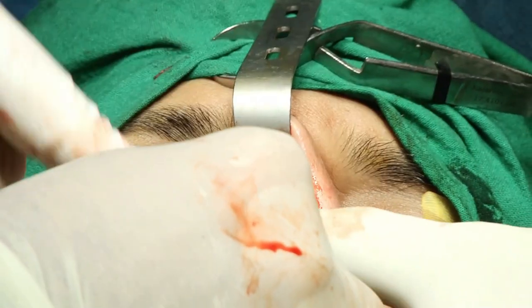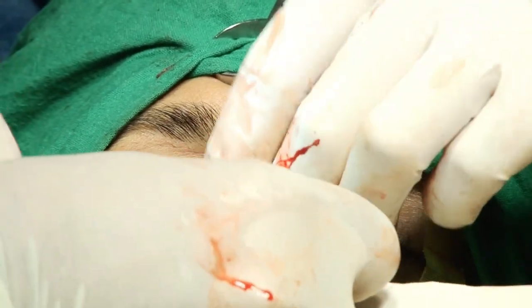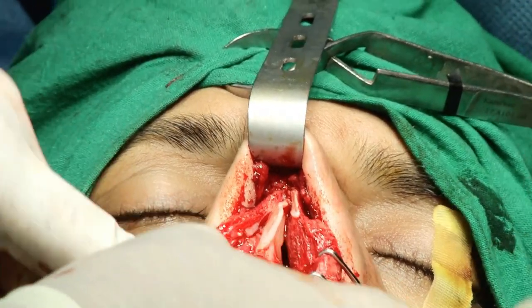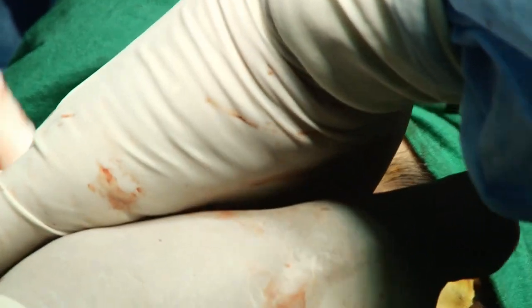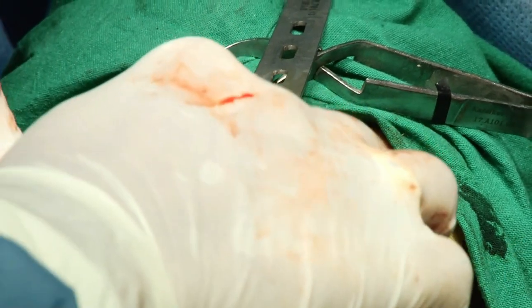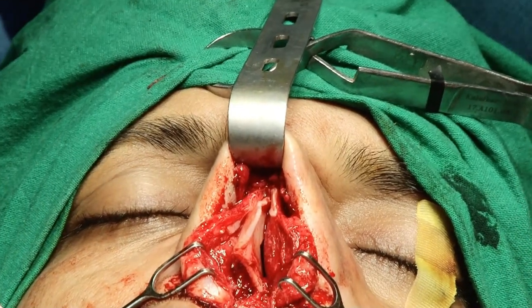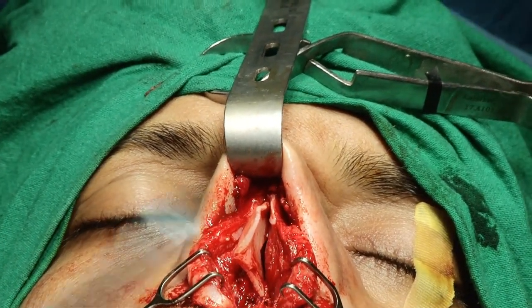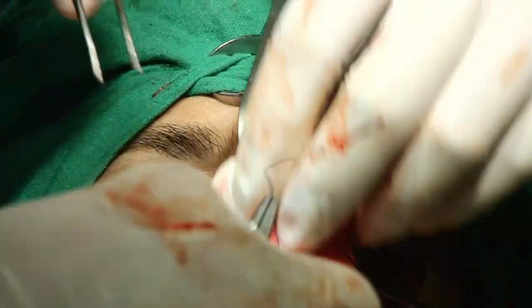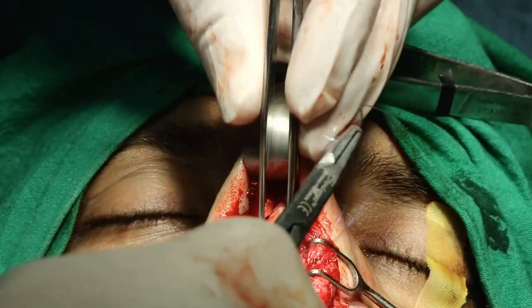Osteotomy, because sometimes you do the crude work first, because if you put the graft and then the osteotomies are hurting it, so like this.